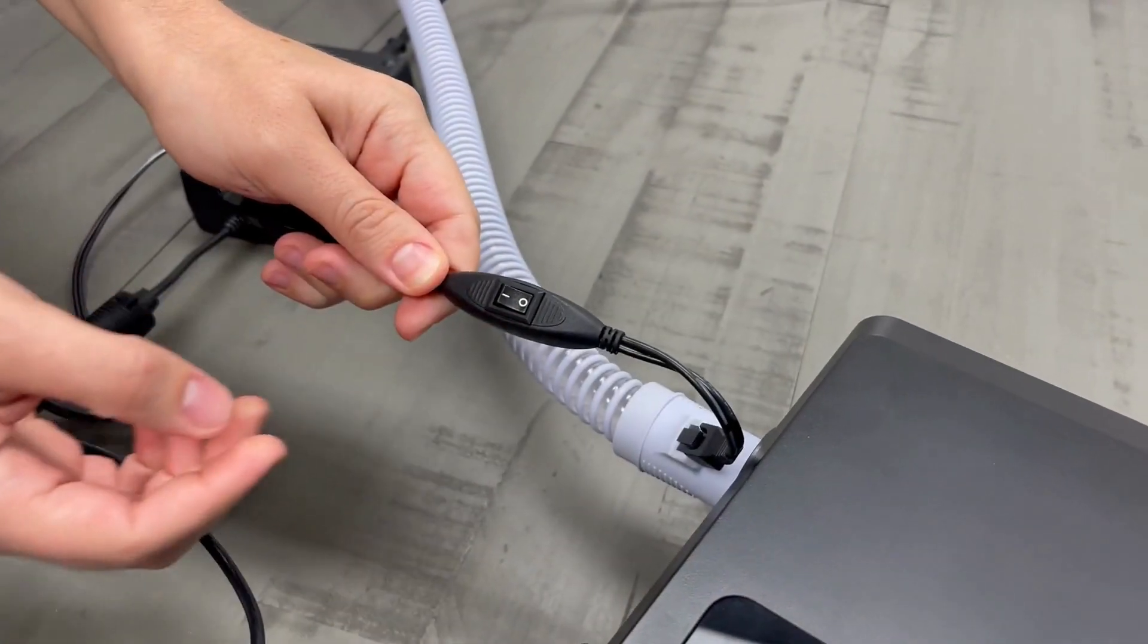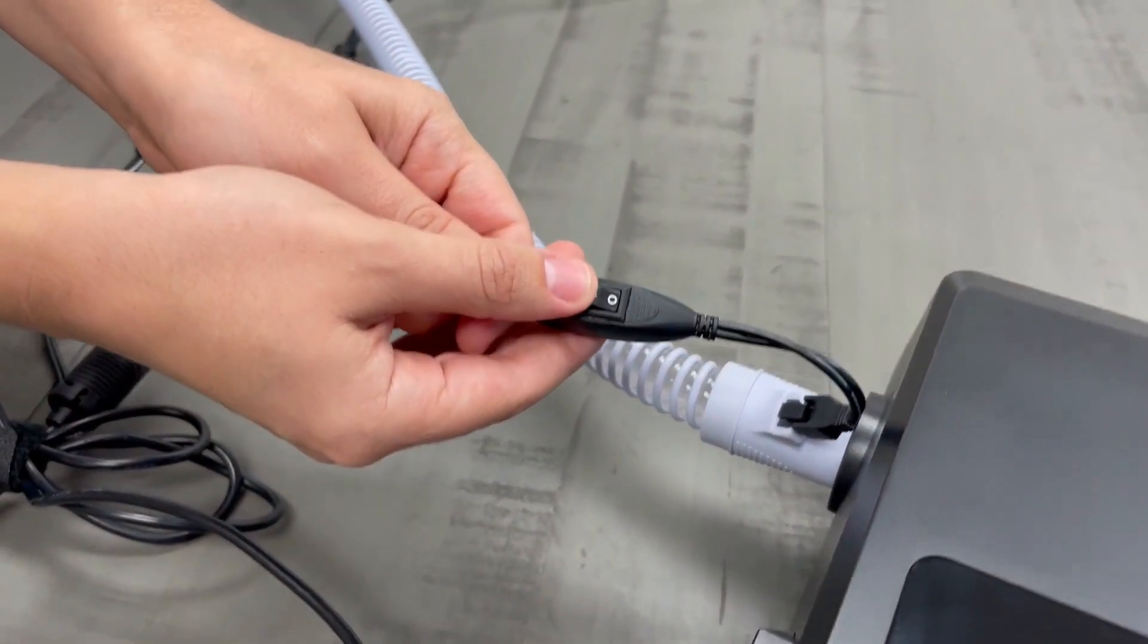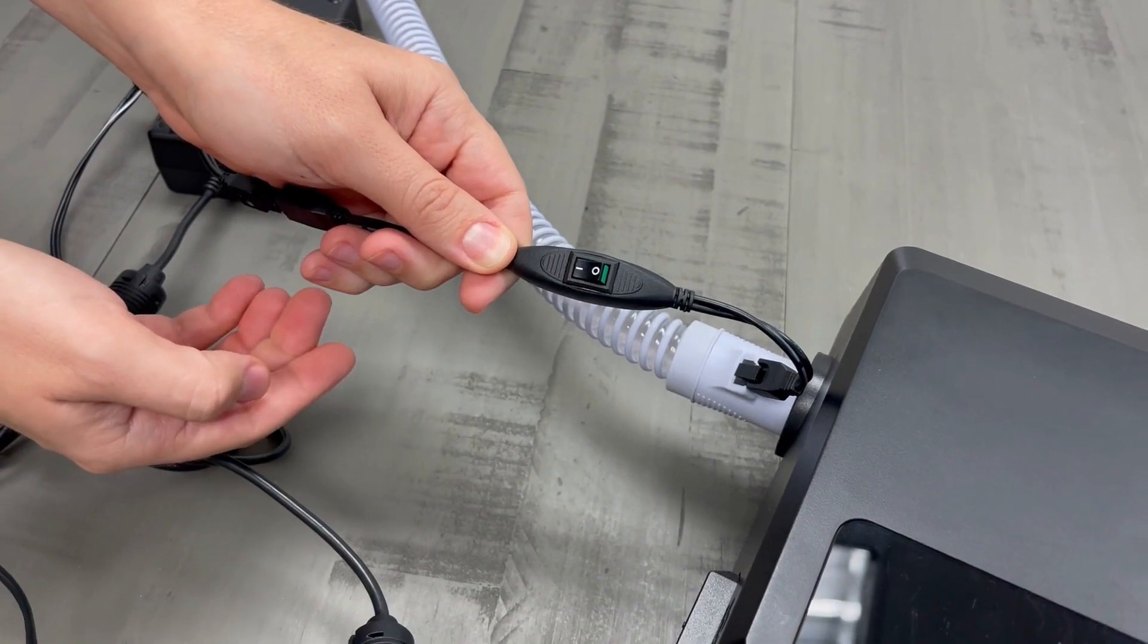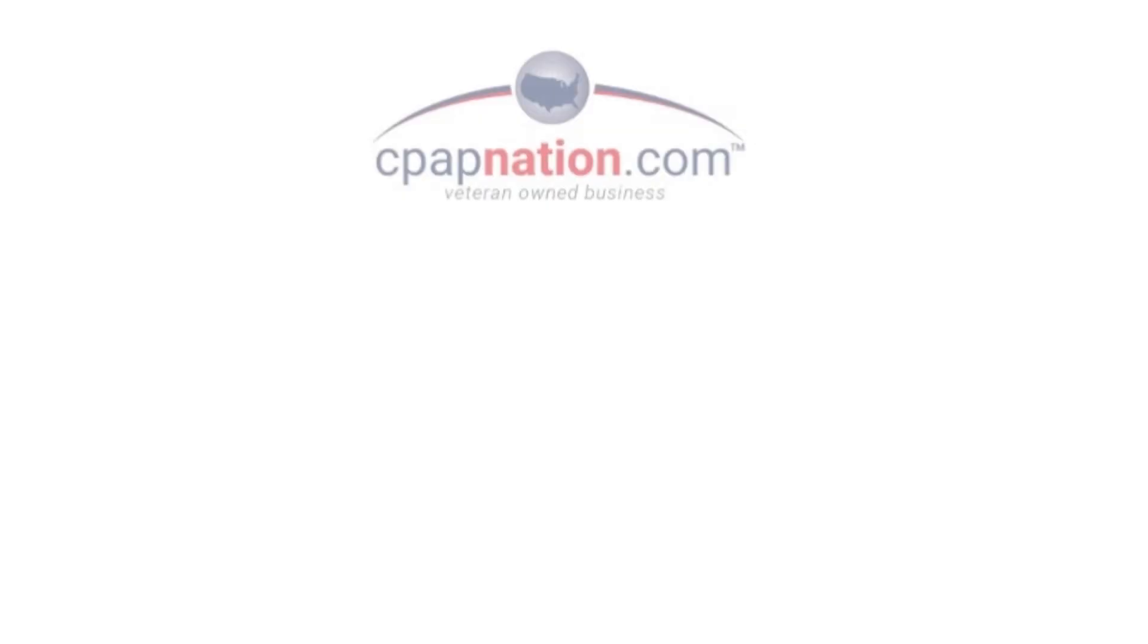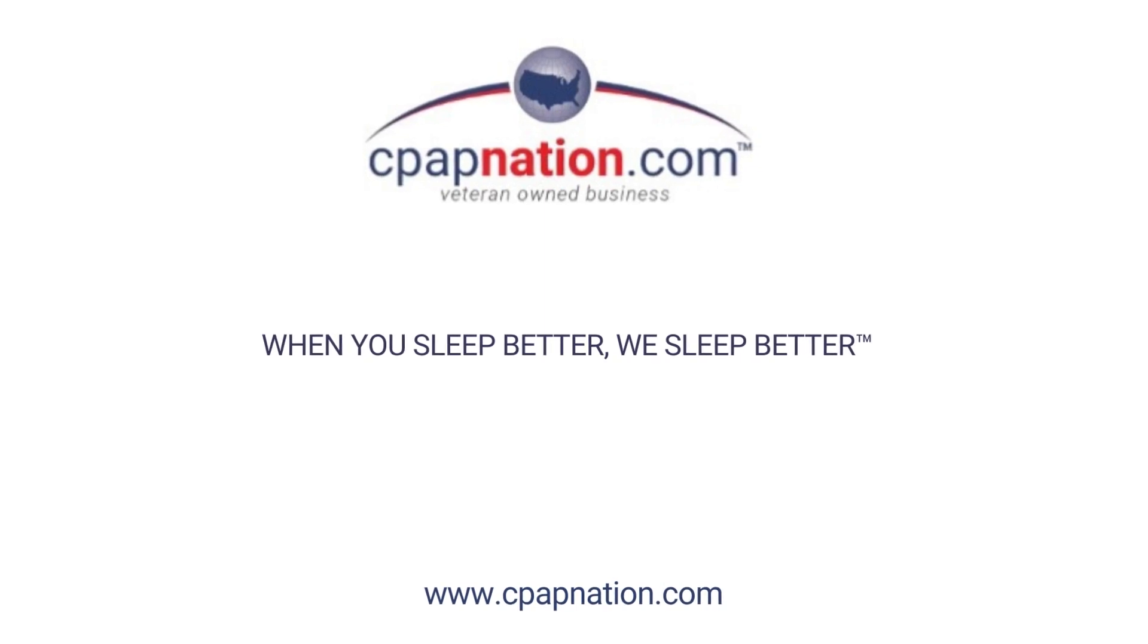Use the toggle switch to turn the heat feature on and off as needed. Make sure the power to the tubing is turned off when not in use. Now you are all set up and ready to go.